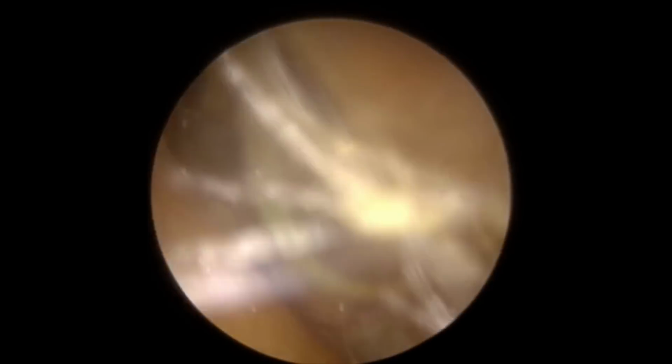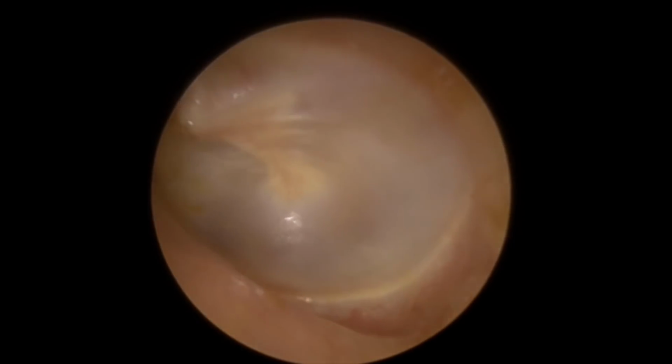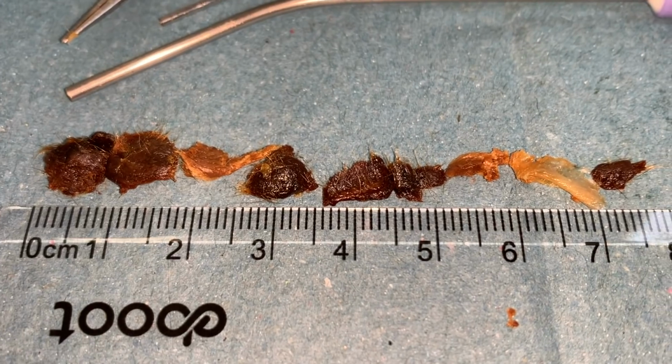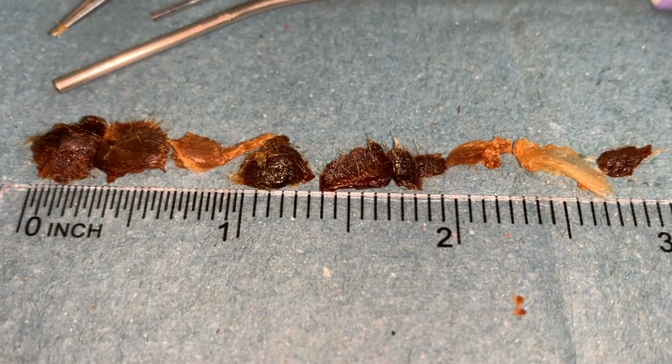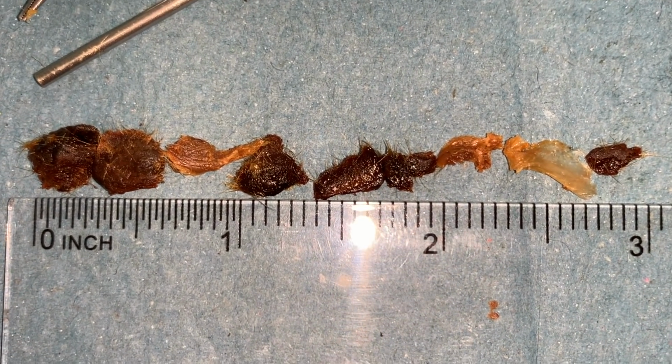There we go. We'll take a look in there, and there's the eardrum there looking nice and healthy. Brilliant. So this is what we removed. So you can see lots of different color variation in here. You can see the long strips of skin as well in there. So that was those pockets that we removed. So yeah, on the whole, quite a bit in those ears.